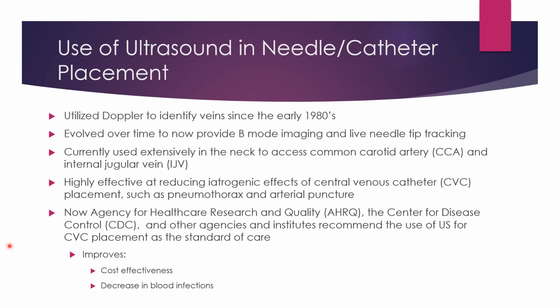So the use of ultrasound in needle catheter placement, the origins really started out in the 1980s when they started developing more technology to allow for color and spectral Doppler scanning. At that point, we became better able to decipher arteries from veins and where veins were located.